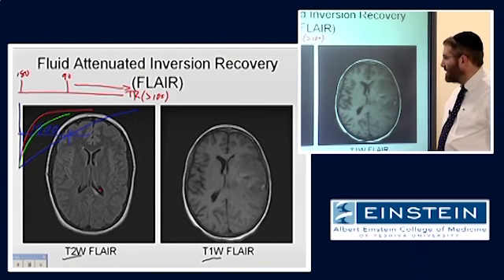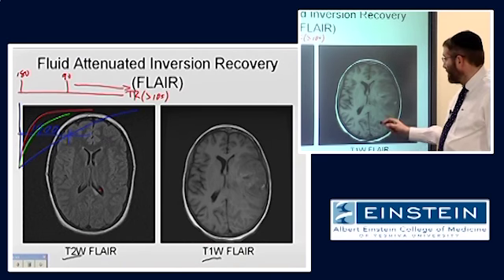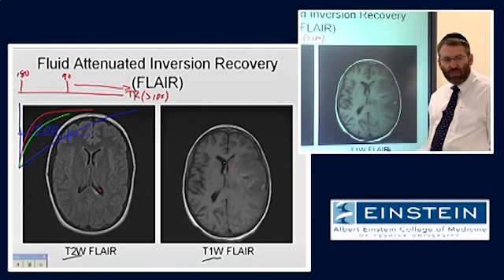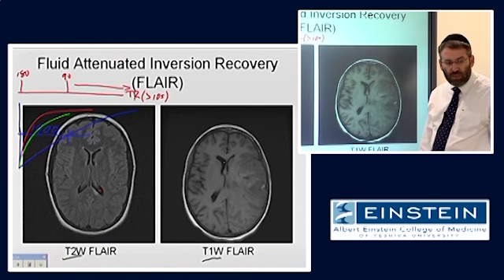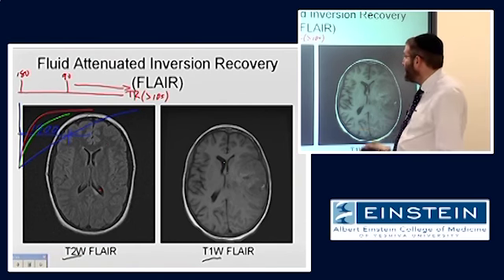So what's this idea of T1 weighted FLAIR images? Well, this looks like a T1 weighted image. Compared to your sort of typical spin echo T1 weighted images, the contrast between CSF and tissue is much greater. The CSF is much blacker. You get these images with this beautifully jet black CSF that nicely outlines all of the sulci. So how do we do this? Well, it's really the same idea.